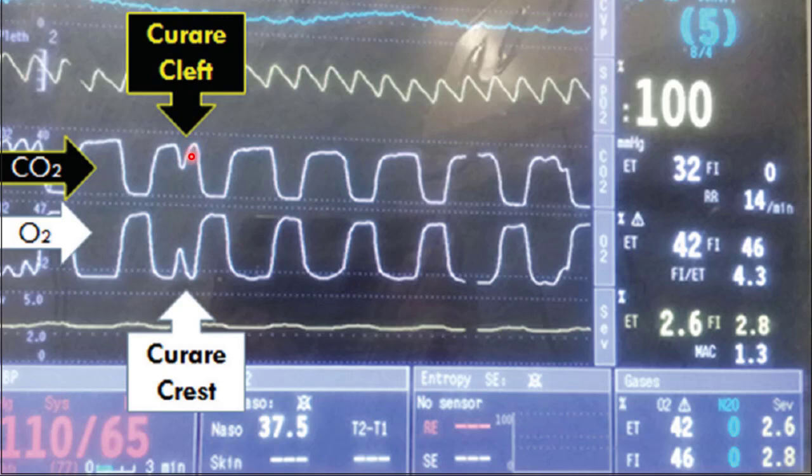It just may be continuation of the ventilation controlled exhalation. And return down, and then you see this notch down here corresponding. This is inflow. This is the patient breathing in, and when they breathe in, CO2 briefly drops. So you can match these up and say absolutely this is lack of sedation. The patient needs more sedation, so on and so forth. This is a great example.